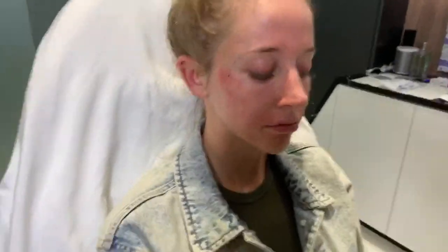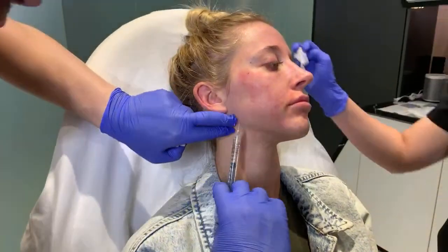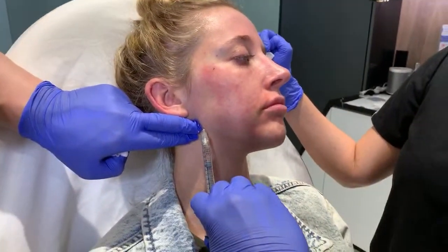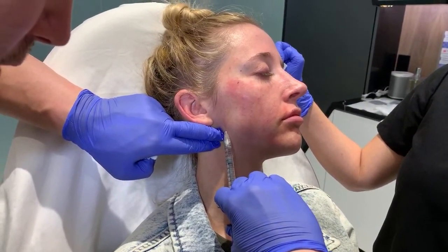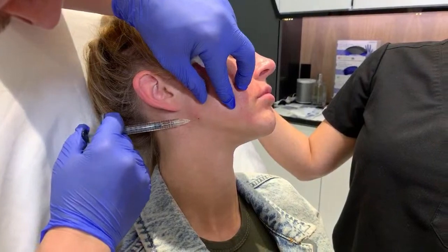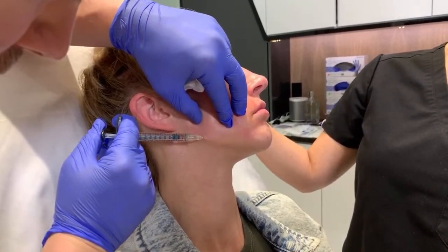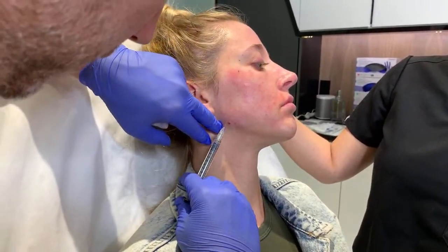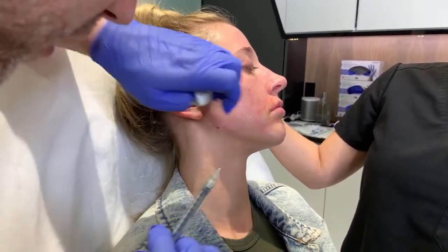Do you want to do it? No, go ahead. Okay. You can see from the front? Very good. Okay. Turn now this way. So we're going to show you this 90-degree angle. And again, we're going to go right back to the edge of the jaw. Just do little threads. Very subtle amount. Give a little bit of structure at this 90-degree angle. And this will give her face a more structured, contoured look. She's super slim, but it also will balance what she had done in her middle face and chin.